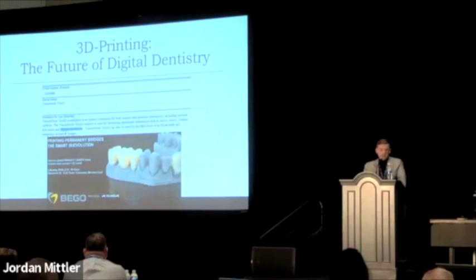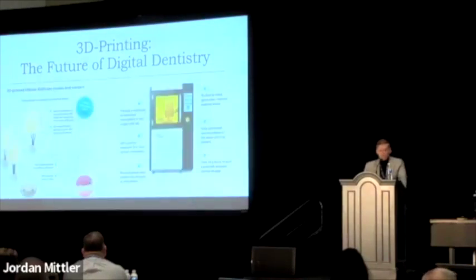Later on this month at Lab Day Chicago, Bego, another major resin company, is releasing their first resin that's FDA approved for multi-unit restorations, so three-unit bridges. So we're going to be beyond just single-unit definitive crowns. This is a really interesting printer, a little bit different than the traditional resin printers we've been talking about. This was released in Germany last year. This is printing Emax, okay? And this printer also has the ability to print zirconia. So I'm hopeful that within a short time frame, we will have better access to these in the dental offices.